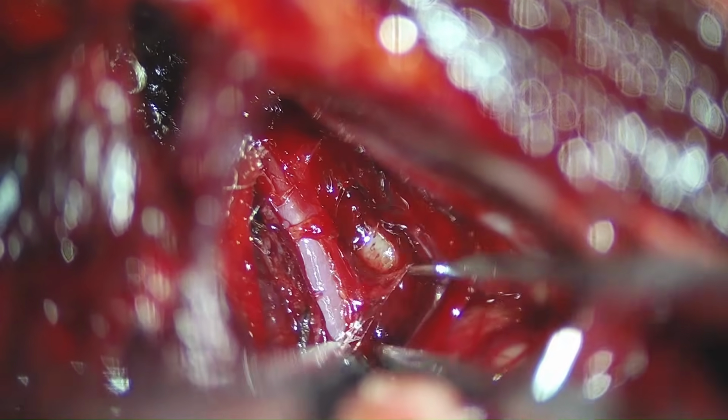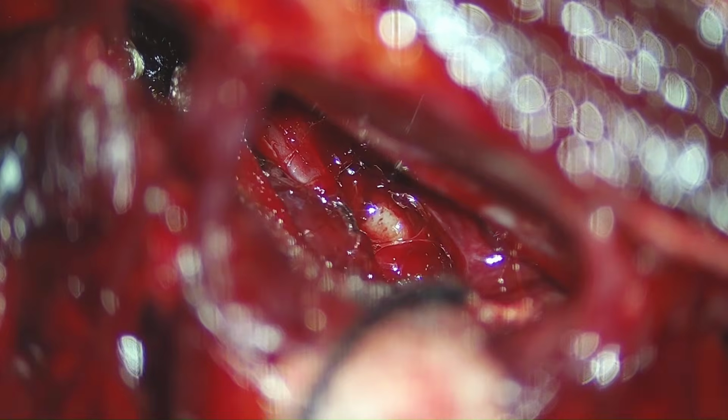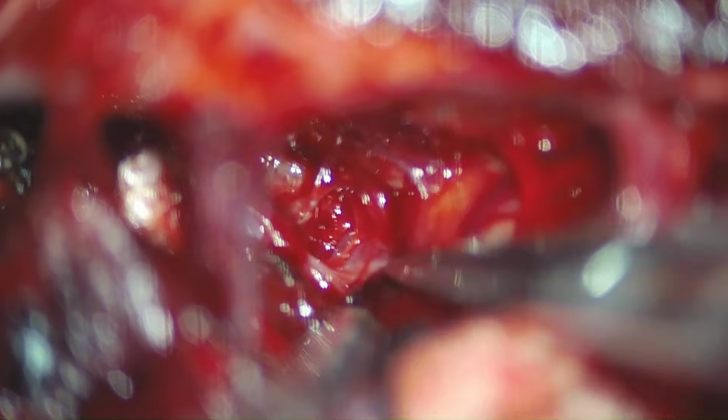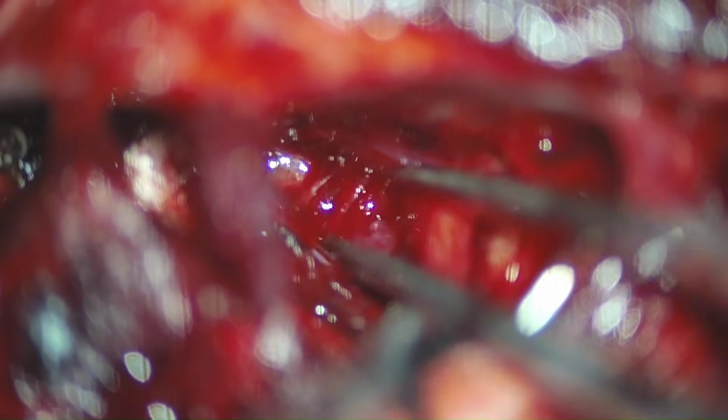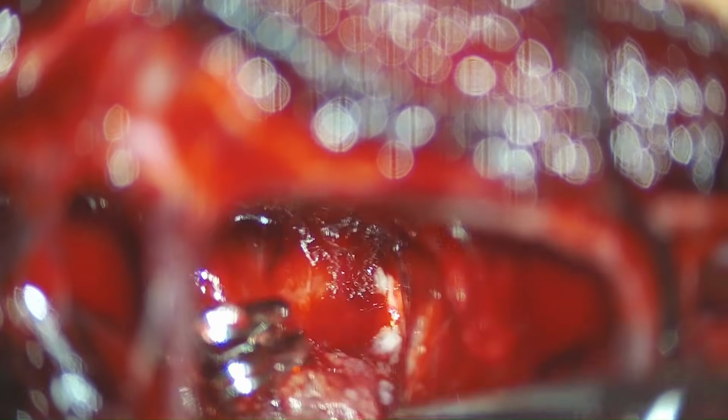So we have to remove the arachnoid attachments and tear out the draining veins into the superior sagittal sinus, leaving a small corridor into the brain. Once this has been achieved, we started following a branch of the marginal callosal artery which is directly visible, and we could see there are many adhesions around the vessel with a large clot present in the interhemispheric area. So we slowly removed the clot and followed the branch of the marginal callosal artery which led us to the marginal callosal artery proper.